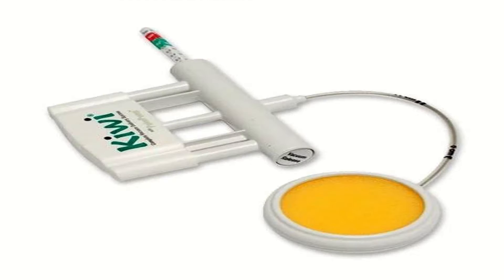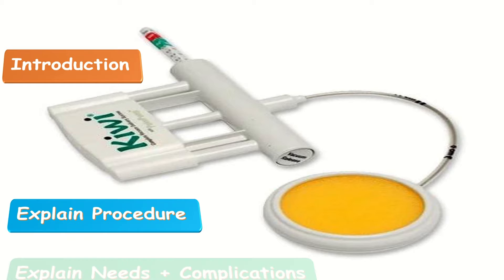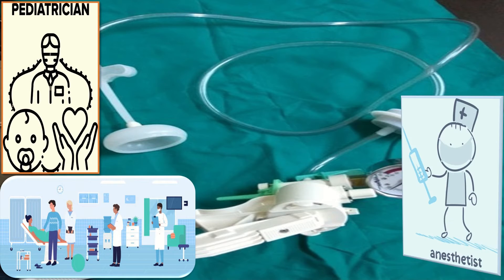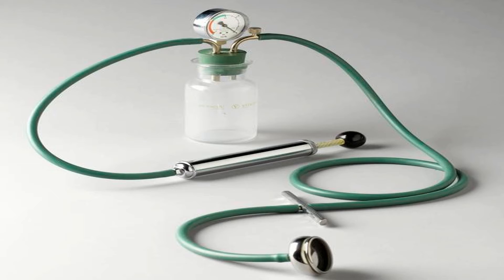I will introduce myself to the couple, explain the whole procedure, its needs and complications, and take an informed consent. After fulfilling all the prerequisites, and in the presence of senior staff, pediatrician, anesthetist, and myself as the obstetrician, I will proceed with the ventouse delivery. I will check the fetal heart rate first.